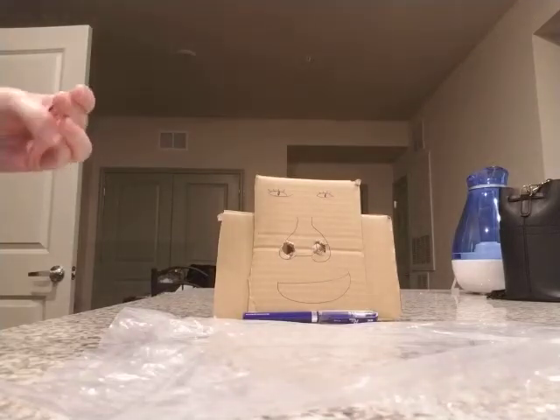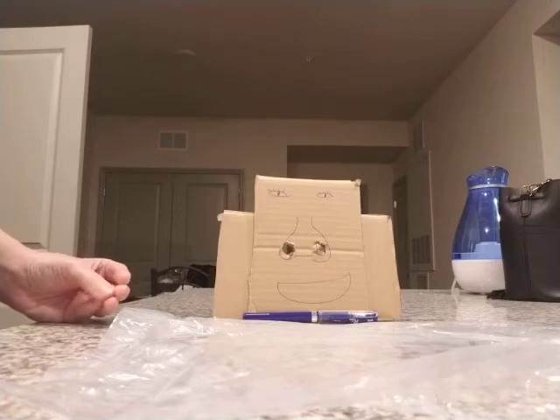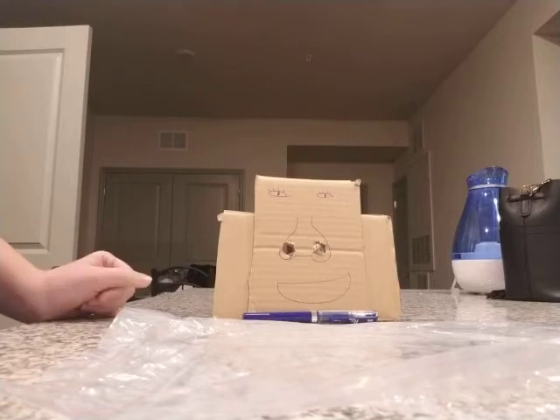So the first thing we're going to do is check the MAR for the physician's orders, the type of NG tube we're going to be placing, and the purpose of the tube's placement today. I'm going to enter the patient's room and pull the curtain closed for privacy.